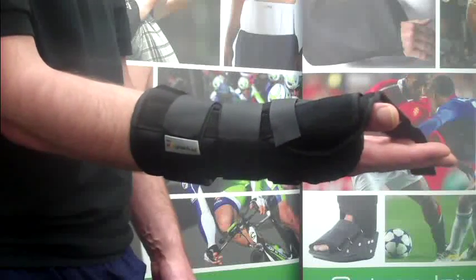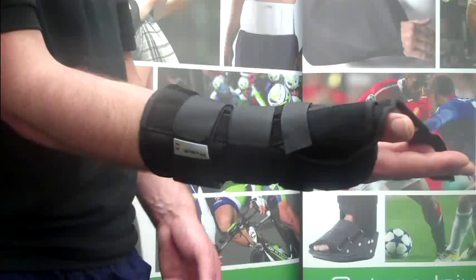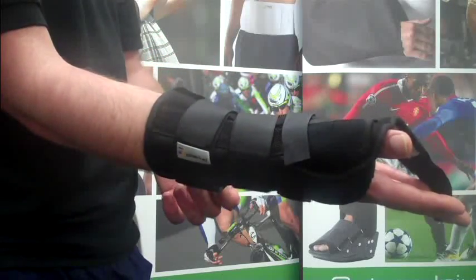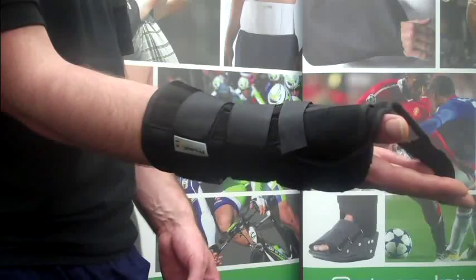A plastic shell and splint acts as a cast to protect and immobilise the wrist and thumb. But compared to a plastic cast, the PhysioRoom.com Wrist Brace with Thumb Splint is far easier to wear and can be taken off to wash and carry out supervised exercises. This aids the healing process.